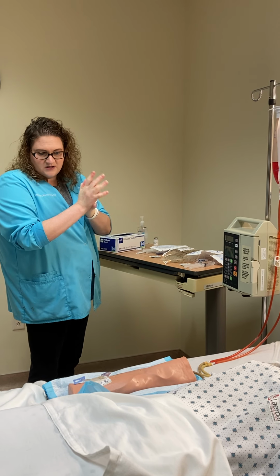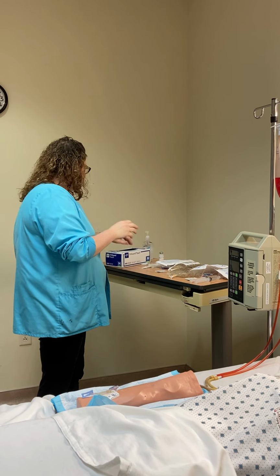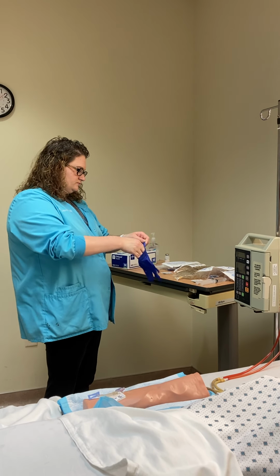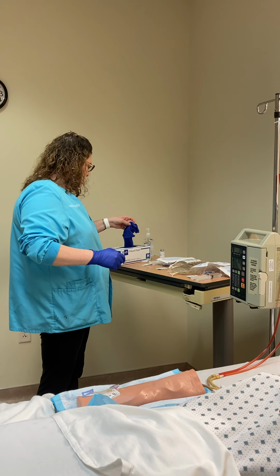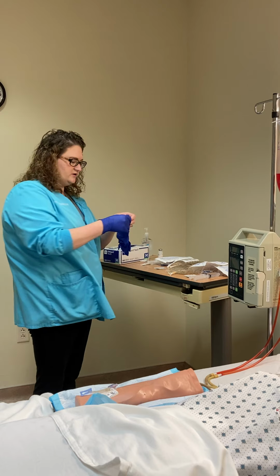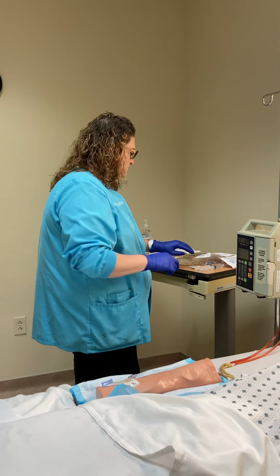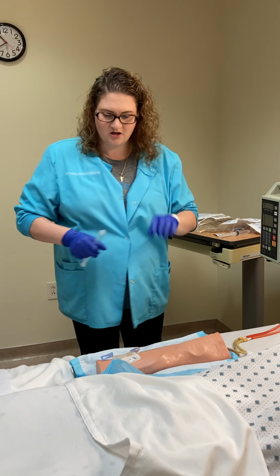Okay, so the next part would be flushing the IV. You always want to have your gloves on when you're accessing your line here. You need your swabs, you need a flush, okay?